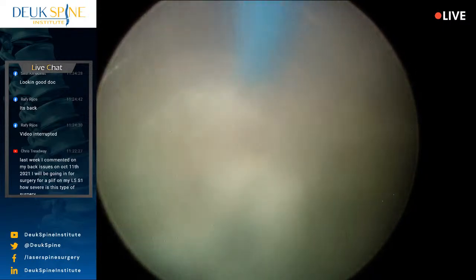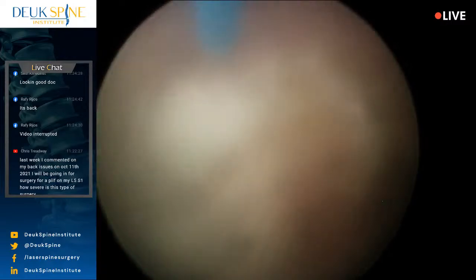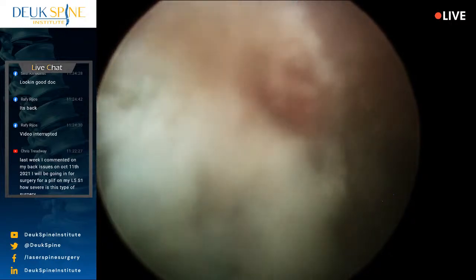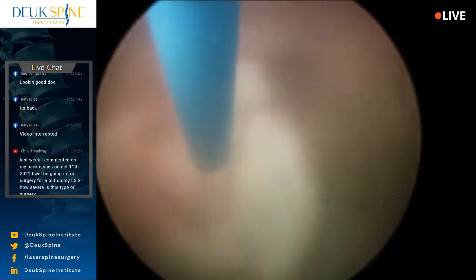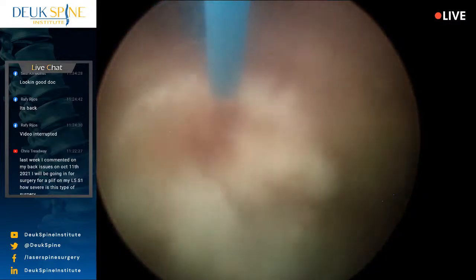Now the debridement I'm doing to the annulus is the key to eliminating back pain, but also the key to healing the disc so she doesn't get a recurrent herniation. Okay? Now the annular debridement that I'm working on is actually not done in any other type of spine surgery. Only the Deuk laser disc repair currently is the only surgery that does the annular debridement.